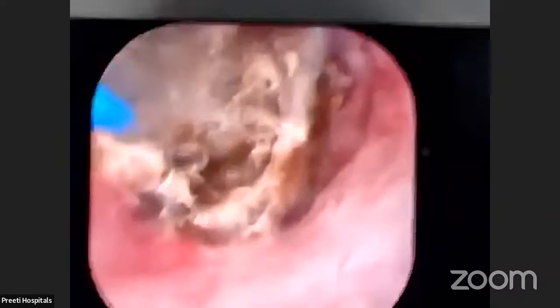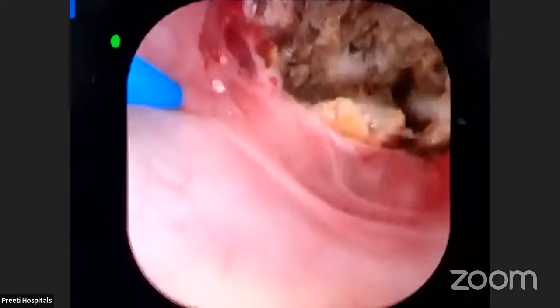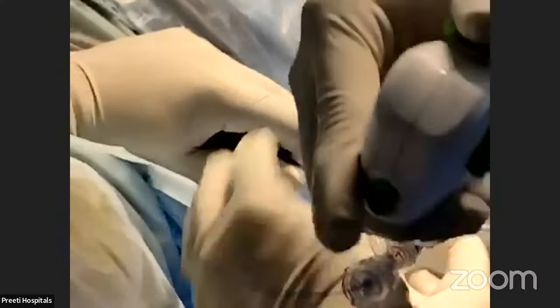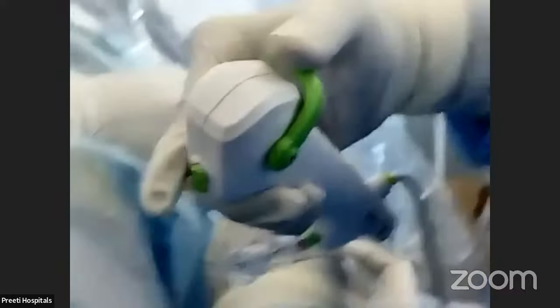But for that, the access sheath today, because he is a tall patient, is falling short. That's why, you see here what he is doing, he is pushing the tip of the penis like this and making the access sheath go inside. He is reducing the penile length. This is the only place where penile length matters. You got the point?